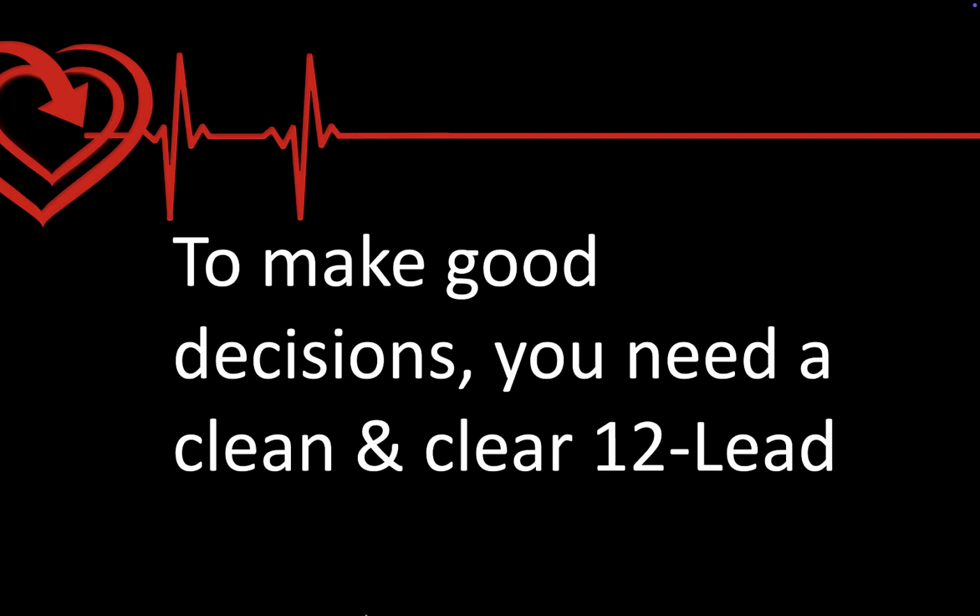The next thing I want to mention is how you make sure that your 12 lead that you've just captured is going to be a clean, clear 12 lead that you can make decisions on. Couple of things. Skin prep. These things that I'm going to mention right now are so often overlooked, and they aren't always necessary. Sometimes you can get a good tracing without these steps, but making this a part of your regular practice will improve the chances that you get a good, clean 12 lead.